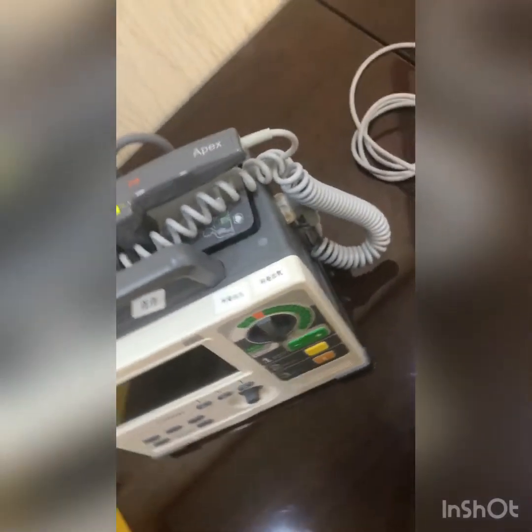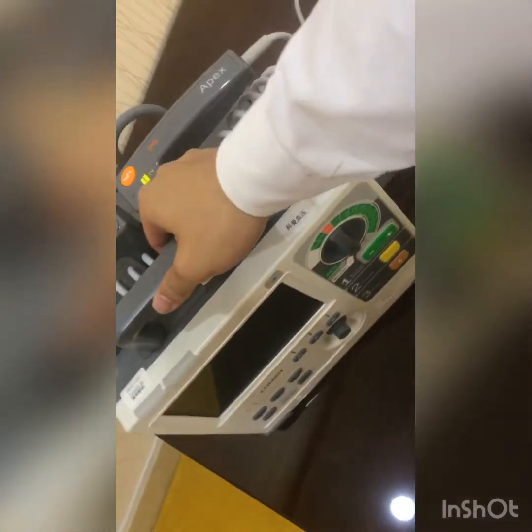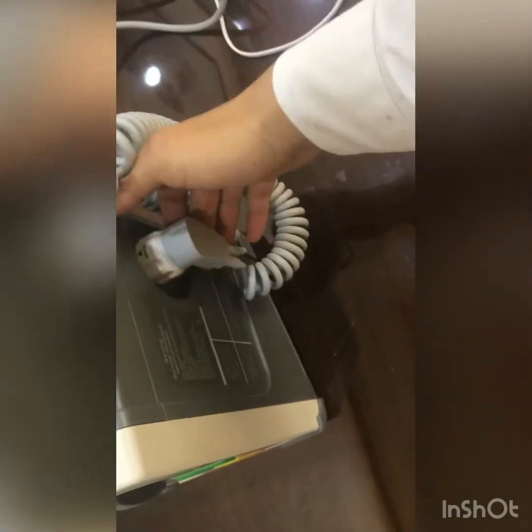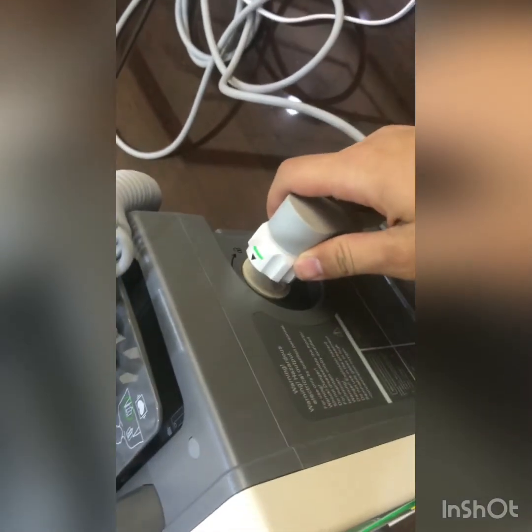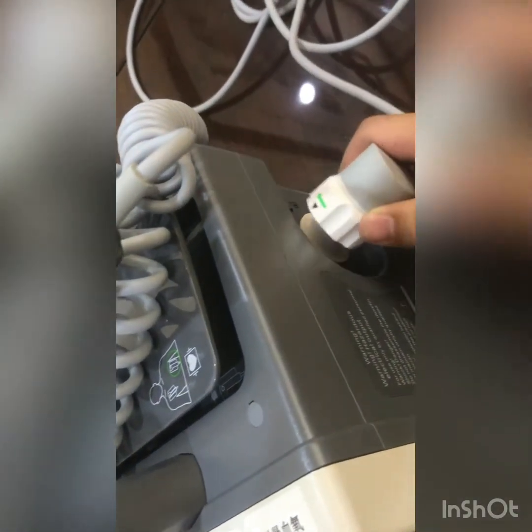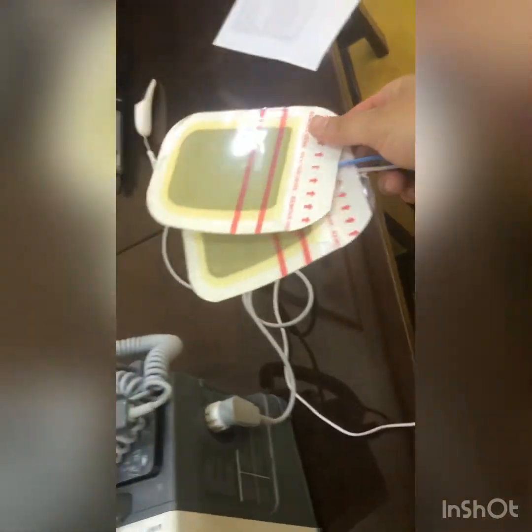And the two paddles can be switched to the pads. Okay, let me show you how to switch. So you can see it's pretty simple and pretty easy to switch.